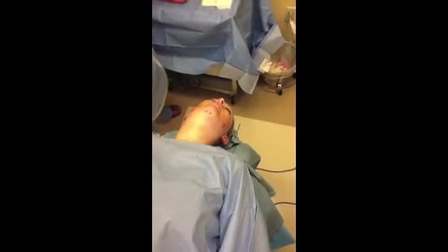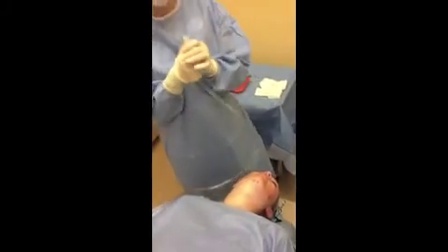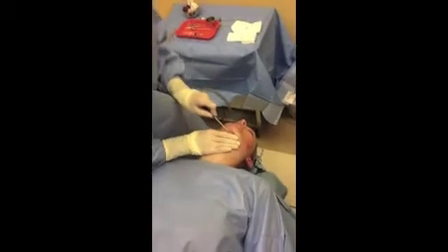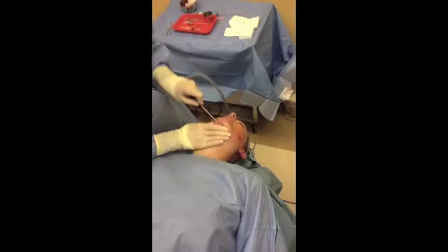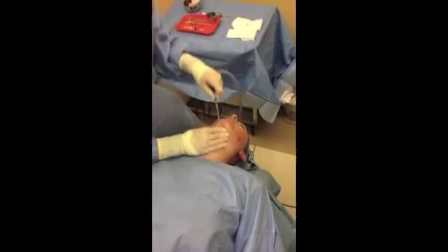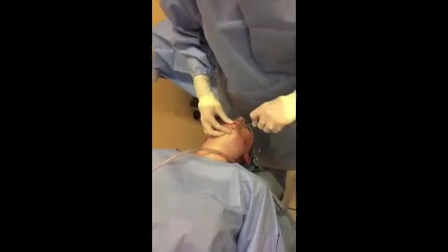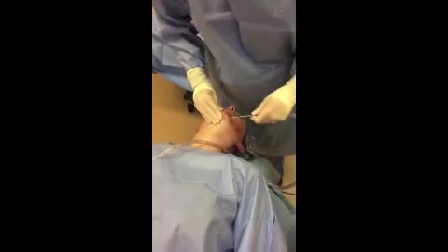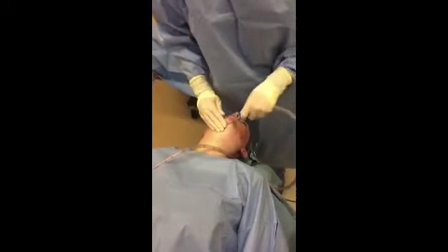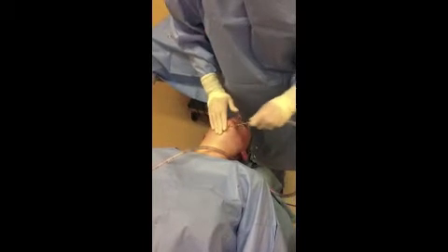What's that? Just a smaller little cannula. Always keeping these towards the tissues, not up towards the skin ever. Do we get a little blood pressure or anything, Mary? It's 110/80. So we've been going for about 15 minutes now, and we're almost done. Oh, I'm sorry.